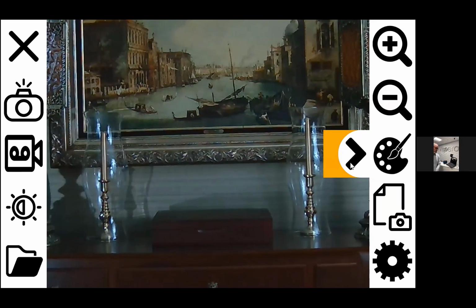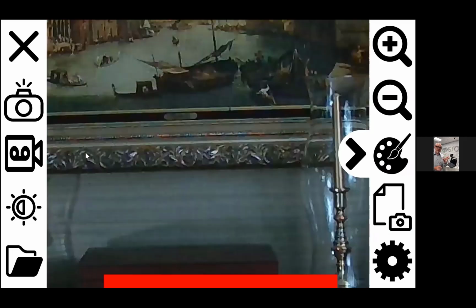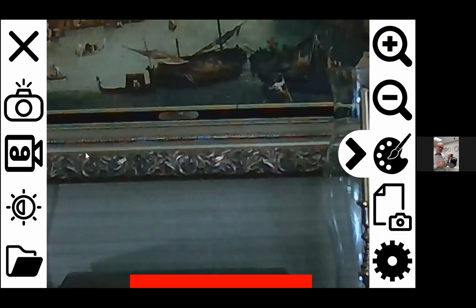So I was just going to say, a great use case for that is, if you use the on-screen controls, the button or mouse using the icons, it will step through the available optical zoom, then go into digital, just like any other magnification device. What's fairly unique about this is you can step up the optical zoom to a level that perhaps hones in on a whiteboard. And then you can activate the digital zoom whenever you like by pinching the screen. So what happens then is that you're essentially maximizing the resolution of optical when you're in the digital, and then you can pan around that live image.